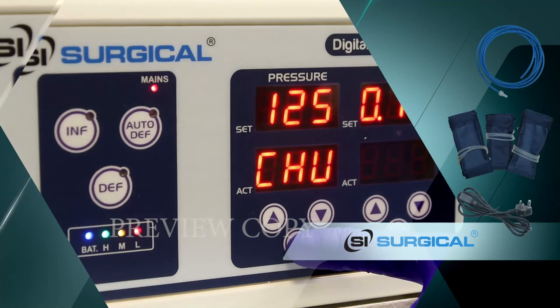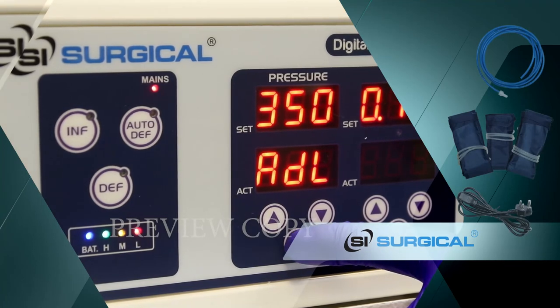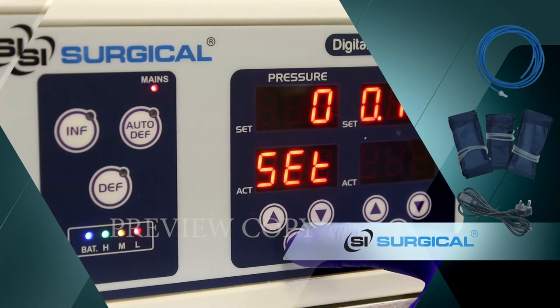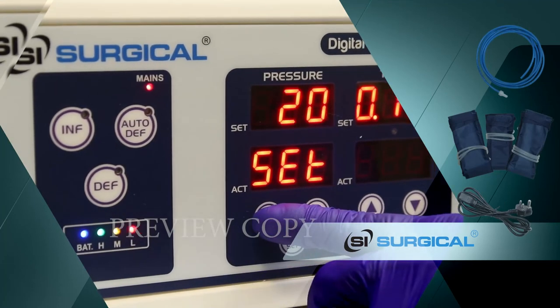For a child, pressure can be set between 100 and 220 maximum. For an adult, the pressure can be set between 200 and 350 maximum.